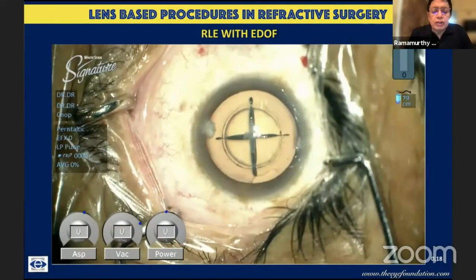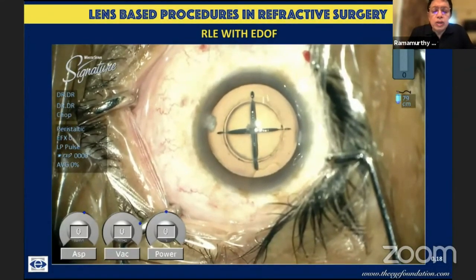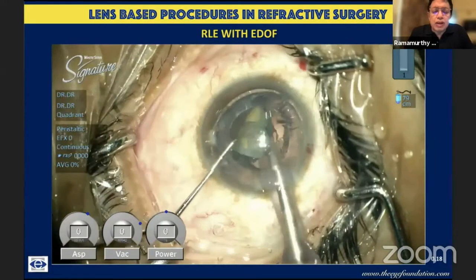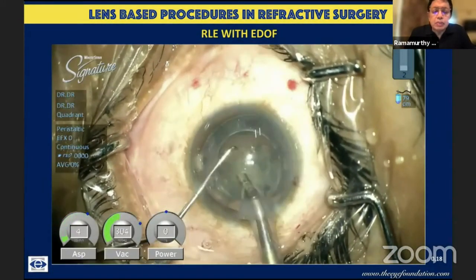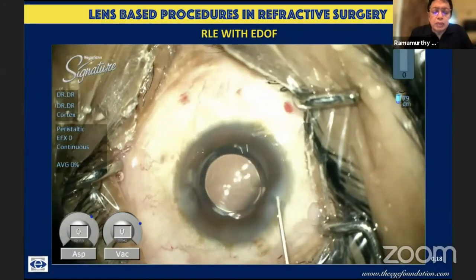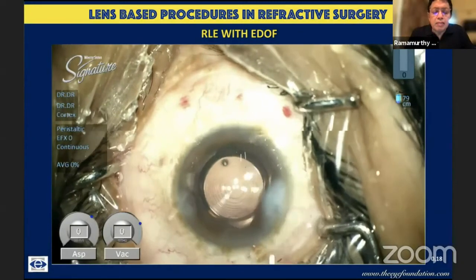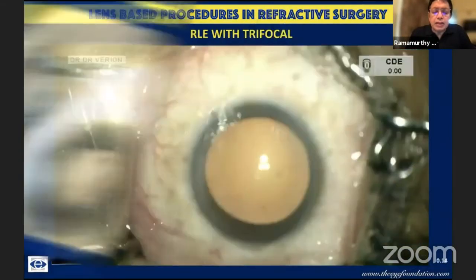Just to show you one of the surgeries that's being performed, here I'm using an EDOF lens. Today, I have almost completely switched over to trifocal and Synergy lenses in these situations. And because it's almost a clear lens, only segmentation has been done. Using gentle parameters, the lens has been removed and you can see the intraocular lens has been implanted.